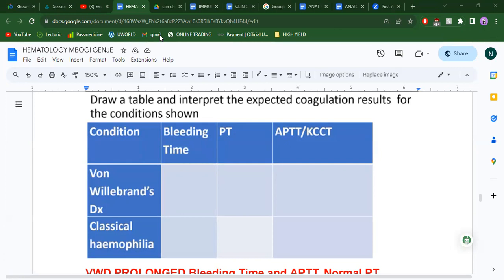Y negative, so when the arrangement changes, is it reverse grouping? Yes, when the arrangement changes, it's reverse grouping. So for the reverse grouping, for the next session, I'm going to put a better table, then I'll explain from there. So you can hold your questions for the reverse grouping. So we can continue. I hope the background noise has subsided.